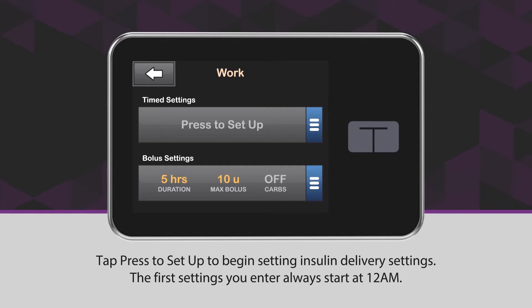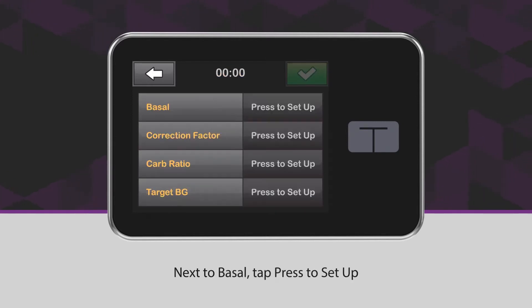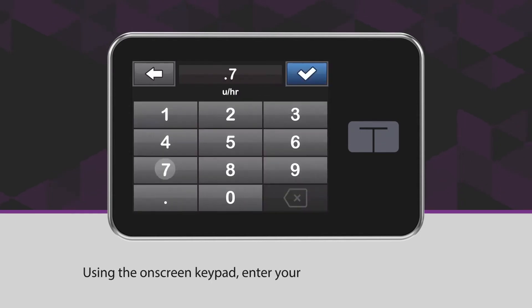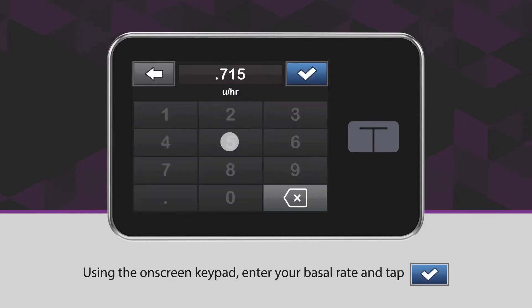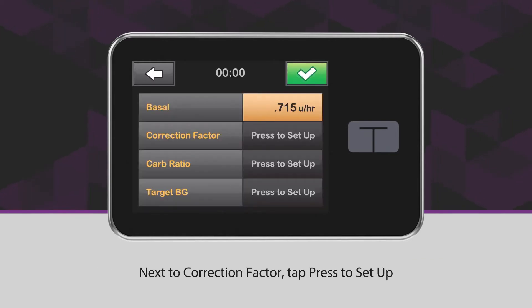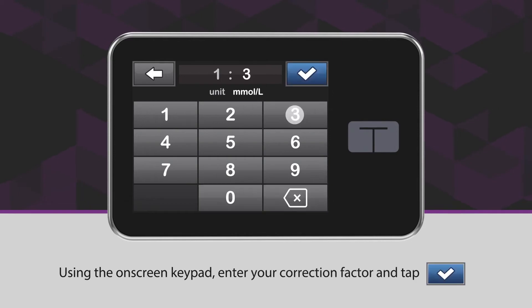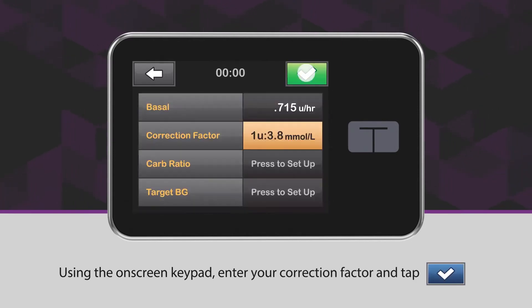The first settings you enter always start at 12 a.m. Next to Basal, tap Press to Set Up. Using the on-screen keypad, enter your basal rate and tap the blue checkmark icon. Next to Correction Factor, tap Press to Set Up. Using the on-screen keypad, enter your correction factor and tap the blue checkmark icon.